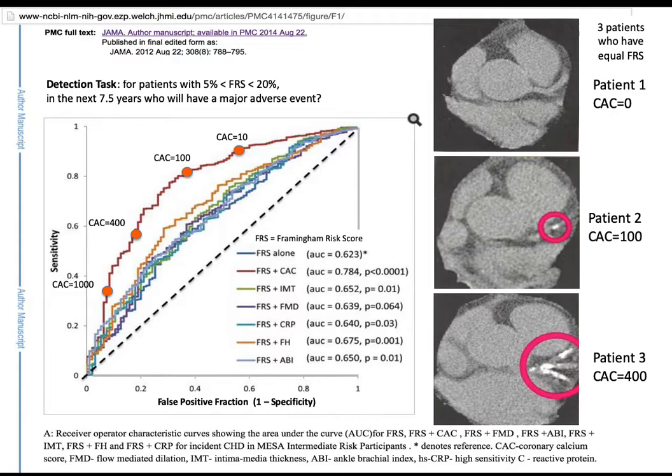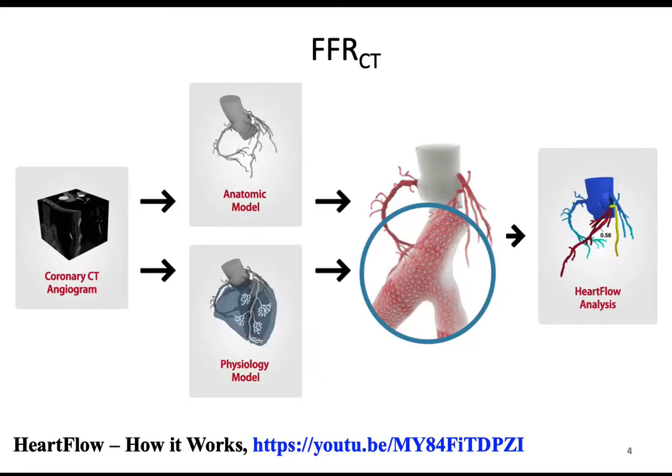Okay, so we've talked about looking at coronary calcium, also delineating whether or not there's a stenosis. Elliot then had some slides showing that there's this discrepancy between stenosis burden or size and the hemodynamic change. Right? And so the gold standard way to tell if a stenosis is clinically significant is to look at the pressure drop across it. So is that stenosis flow limiting? And so usually you would have to snake a catheter all the way down someone's coronary artery. So it's a pretty high level of burden of effort to get all the way there.